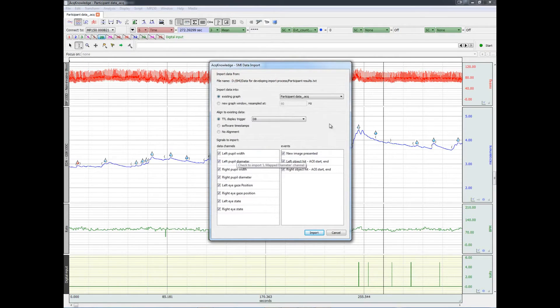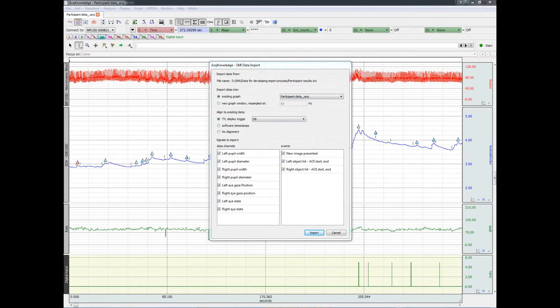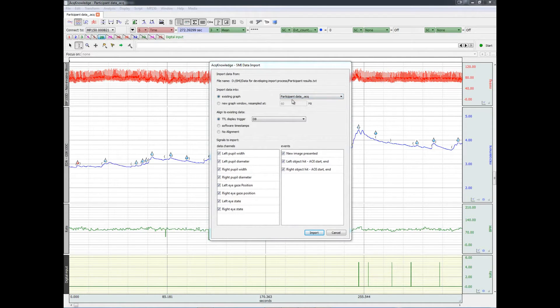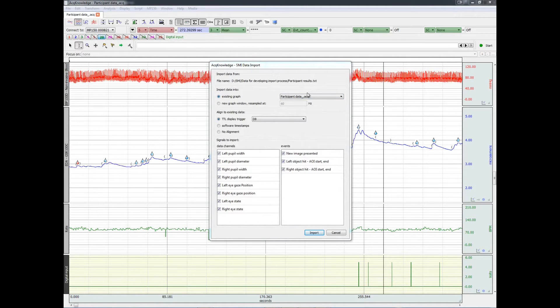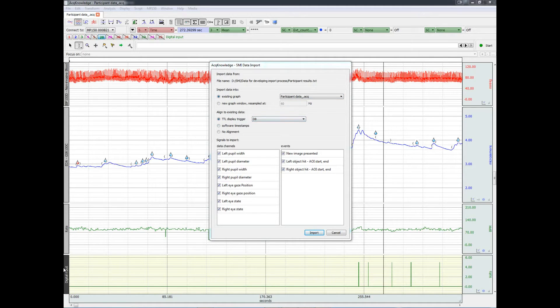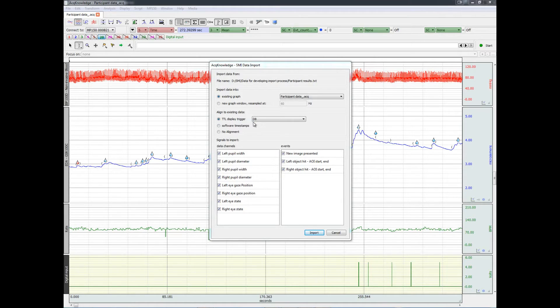Now we have a number of options. What we'll do in this case is import the eye tracking data into the physiological data record. In this case, this is the file name, participant data. And we'll use the TTL trigger on digital channel 8. That's the channel right here, to line up the eye tracking data and the physiological data.